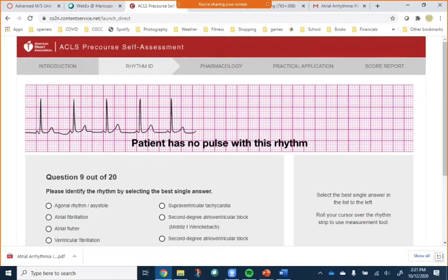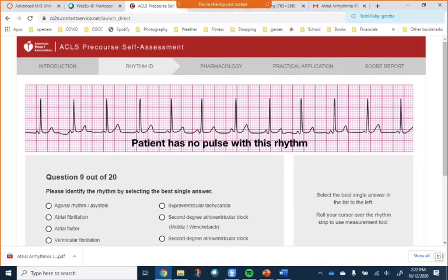And Todd, I'm going to come back to your thought. So you said you thought you saw a sawtooth, which is fine. If you don't have a QRS complex, though, it doesn't matter. There's no atrial. If there's no normal QRS complex, it goes into your ventricular pile, and there's no QRS that's noticeable. So you can't put it in the atrial category because there's no QRS.